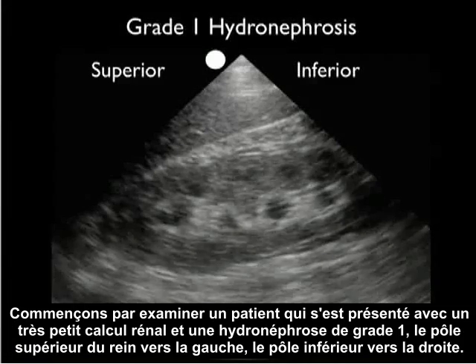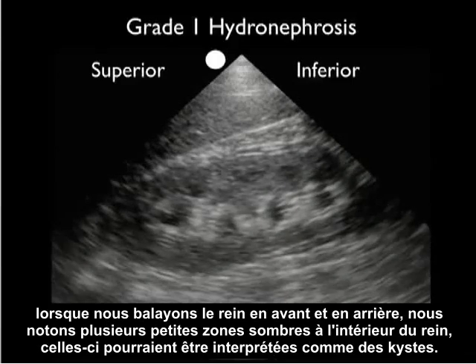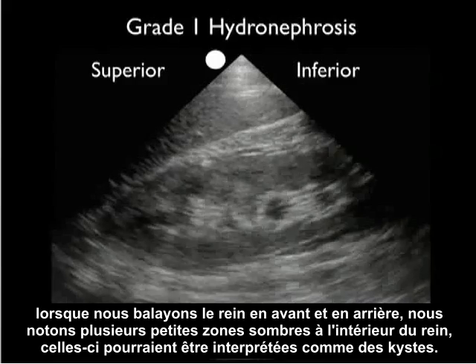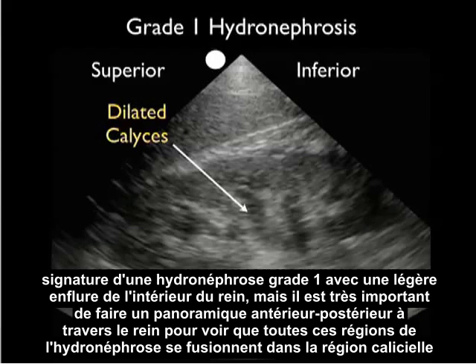Let's begin by taking a look at a patient who presented with a very small kidney stone and grade one hydronephrosis. Superior pole to the left, inferior pole of the kidney to the right. As we scan back and forth through the kidney, we note multiple little dark areas within the interior of the kidney. These could be construed as cysts. However, as we scan up and down through the kidney, we can see that they all coalesce to form dilated calyces — the signature of grade one hydronephrosis with mild swelling of the interior of the kidney. It's very important to fan anterior-posterior through the kidney to see that all of these areas of hydronephrosis coalesce into the calyceal region.